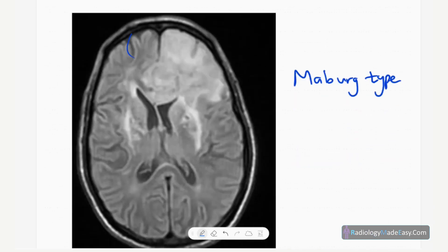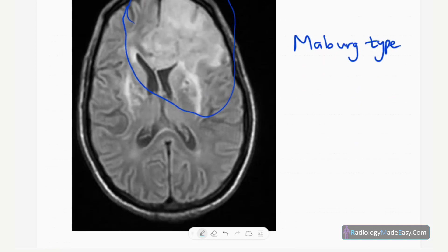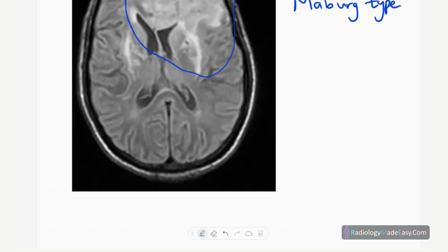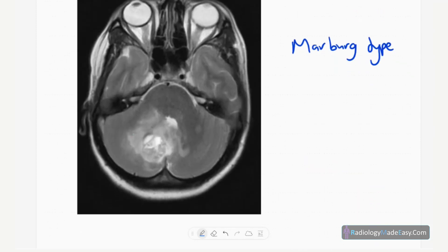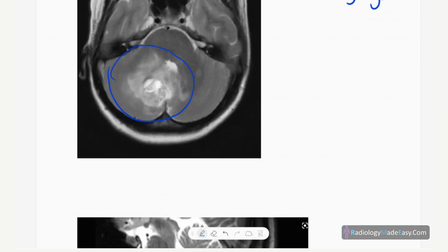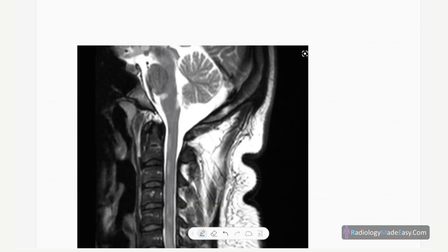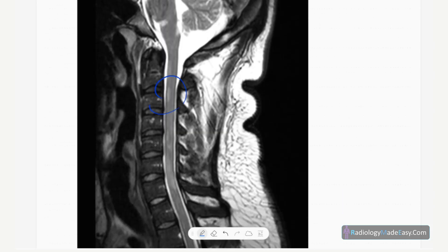This FLAIR image shows a large lesion which mimics a mass or glioma. This is actually Marburg type multiple sclerosis — large lesions that mimic tumors. Another example shows involvement of the cerebellum extending into the brainstem, also a Marburg type. Despite mimicking tumors, this is multiple sclerosis.